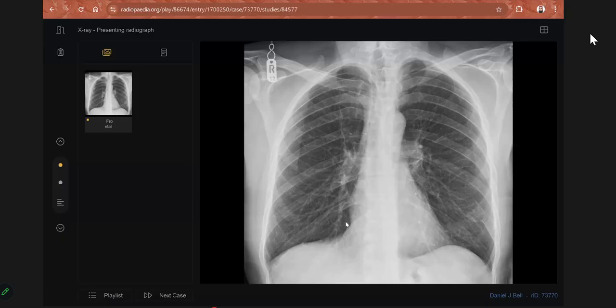Yes. This is the opacity I'm talking about in the cardiophrenic angle. This region is normal, this is the IVC. Anything else? Okay, then there is nothing subdiaphragmatic, and in the retrocardiac areas, I'm looking at my review areas. The apices appear normal, and there is nothing in the retrocardiac region. I'm looking at the axillary regions and the midline. Paravertebral, I cannot appreciate any abnormality.